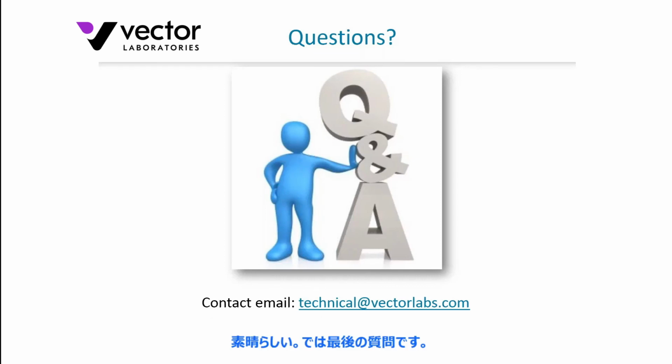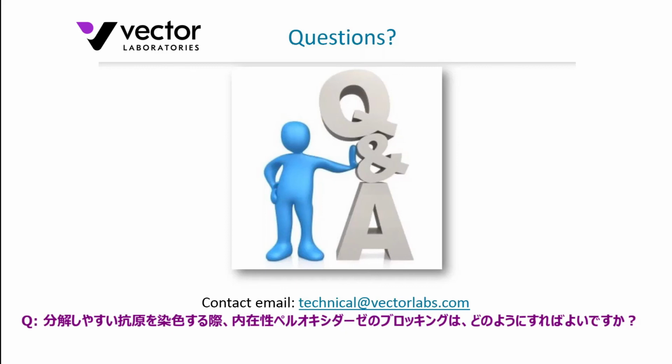Okay, great. And the last question is, how do I quench endogenous peroxidase from fragile membrane markers such as CD4 or CD8? Yeah, some of those membrane markers are particularly susceptible to treatments such as H2O2. Couple of suggestions. One, you could use a very diluted solution of H2O2 and simply let the reaction run longer, say 30 minutes or even longer with say 0.1% H2O2.